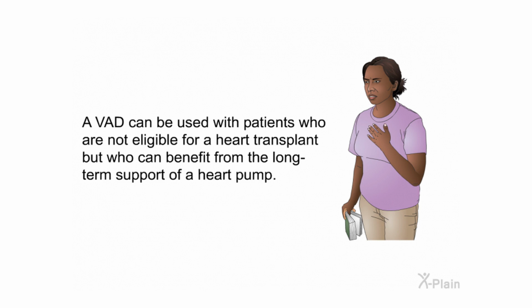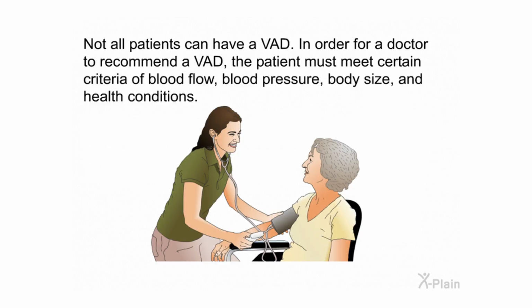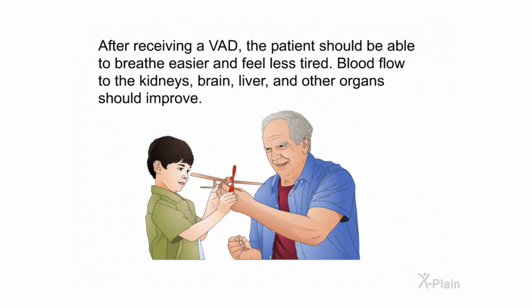A VAD can be used with patients who are not eligible for a heart transplant but who can benefit from the long-term support of a heart pump. Not all patients can have a VAD. In order for a doctor to recommend a VAD, the patient must meet certain criteria of blood flow, blood pressure, body size, and health conditions. After receiving a VAD, the patient should be able to breathe easier and feel less tired. Blood flow to the kidneys, brain, liver, and other organs should improve.